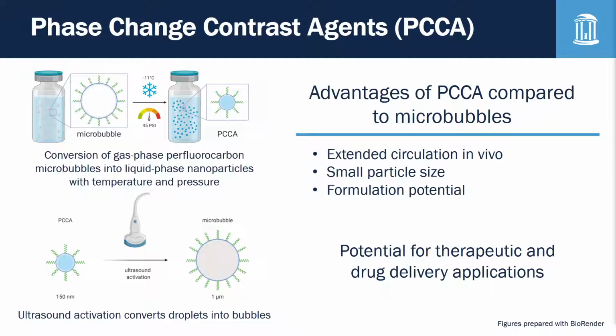Phase change contrast agents are acoustically active nanoparticles that can be made by condensing the gas core of a conventional lipid shell microbubble into a liquid by decreasing the temperature and increasing the pressure. They will remain stable in this condensed state until sufficient ultrasound pressure is applied, which vaporizes the liquid core back into a gas, generating a microbubble.